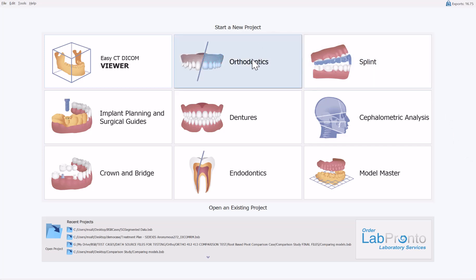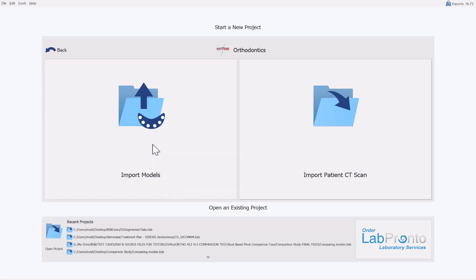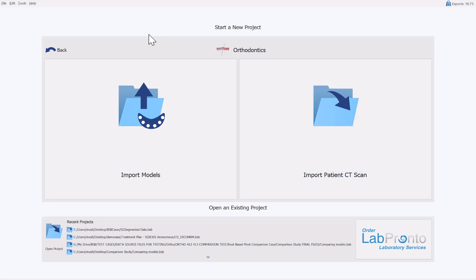If you're running orthodontics aligner design, during the process flow — which we'll look at how to activate and deactivate in just a minute — you'll automatically be prompted to run the relevant segmentation options when importing a CT scan. This gives you true anatomical movement of the teeth for full anatomical data and true biomechanical movements when designing your aligner cases.